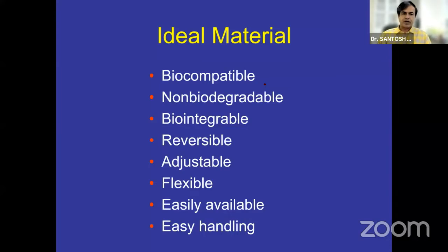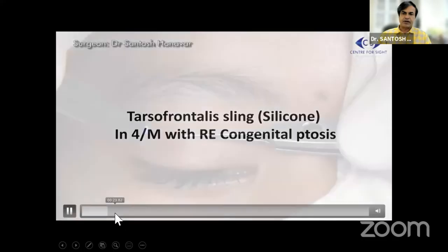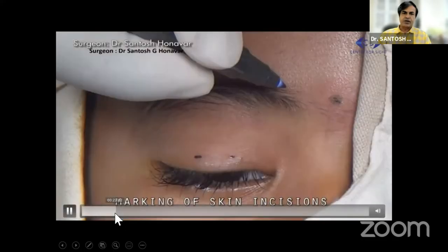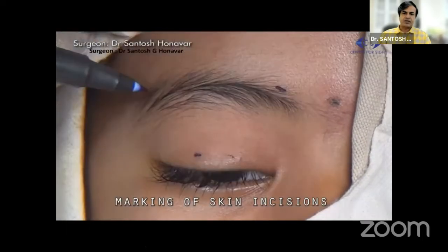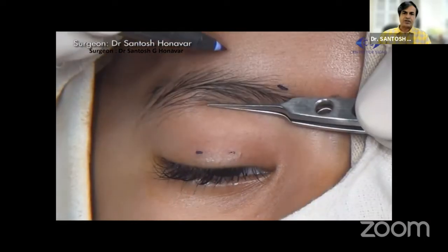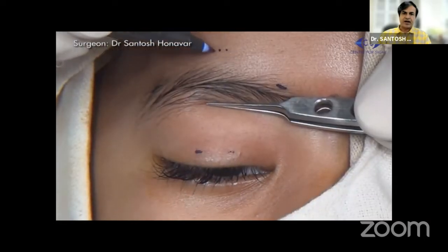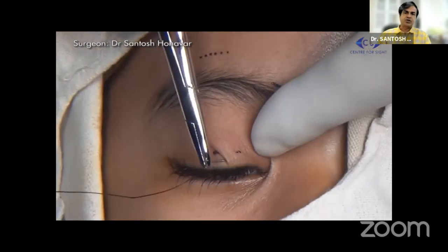This is a video clip that shows the procedure of surgery. It is an 800 micron pre-swaged sling which is available pre-swaged on an atraumatic needle. This is a four-year-old child. We will be doing a pentagon configuration with markings 8 mm apart on either side of the limbus, and the superior medial and superior lateral incisions are in line with the medial and lateral canthi respectively, and the supra-brow incision is about 8 to 10 mm from the superior orbital margin.